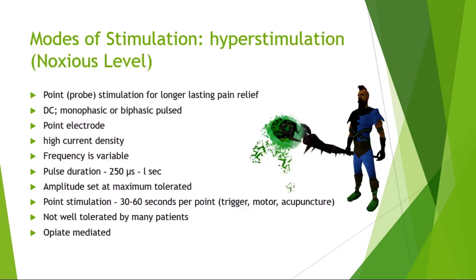So the noxious level, which is hyperstimulation, I've got Captain Noxious superhero there. It's a point probe stimulation for longer lasting pain relief. I've only done this one time. When I was a student, I did a clinical assignment in a clinic where they used this, and it worked, and the patient could tolerate it. But it's not well tolerated by many patients.